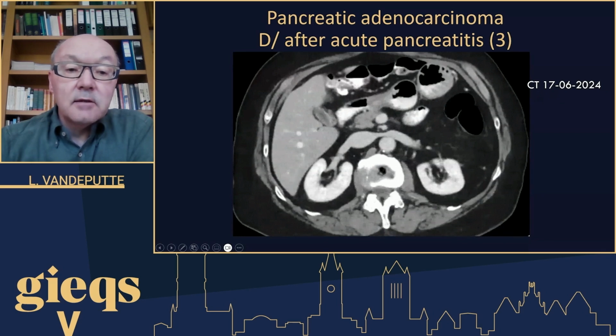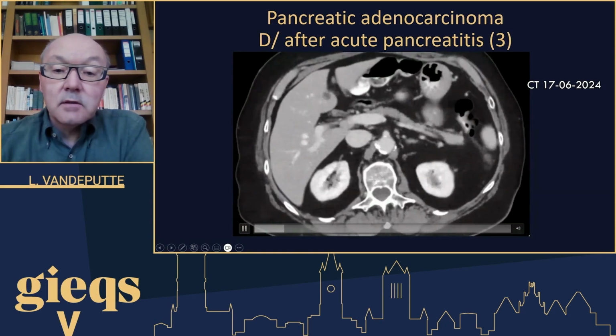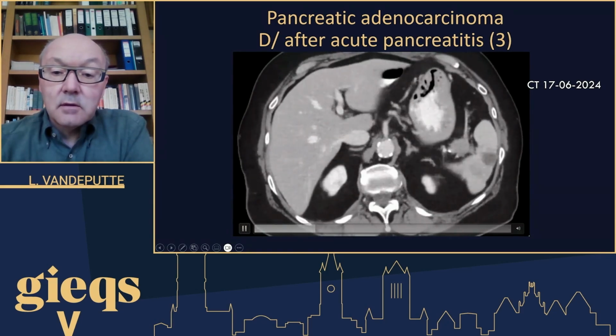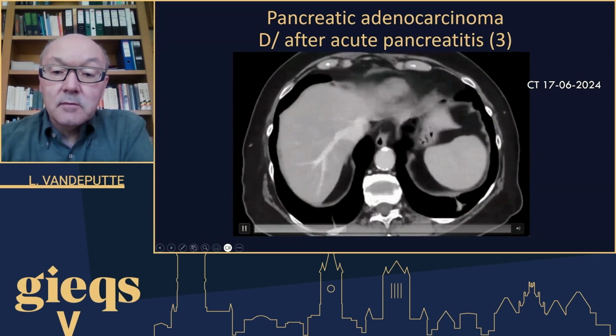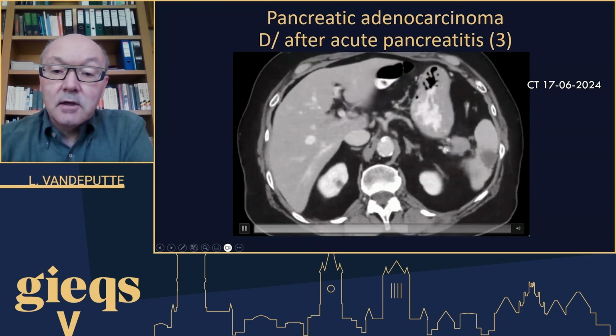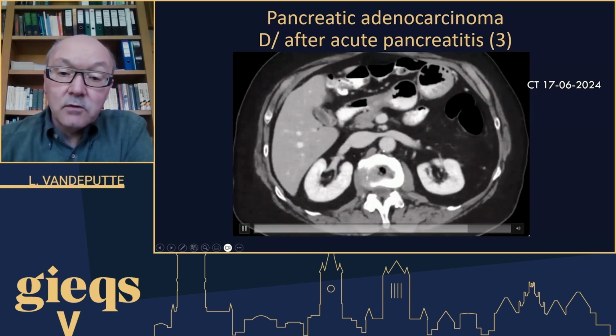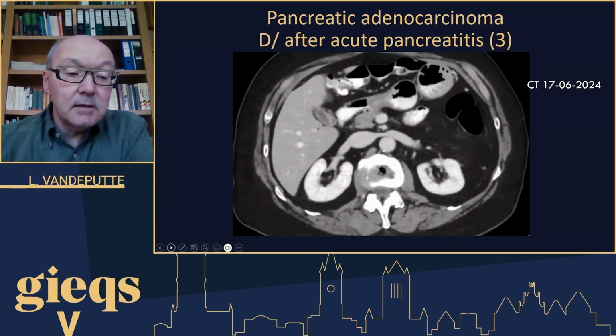Some days later, the patient got a staging CT, confirming the diagnosis. Here you have it, of a tumor which was provoking the pancreatitis 1 month earlier.